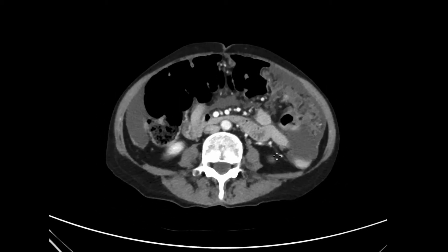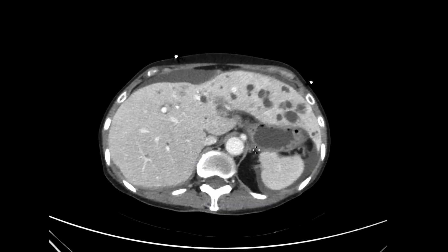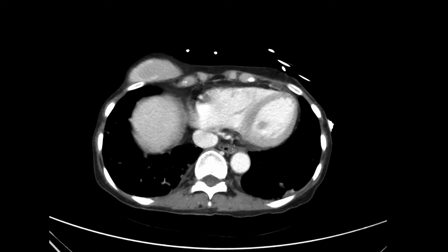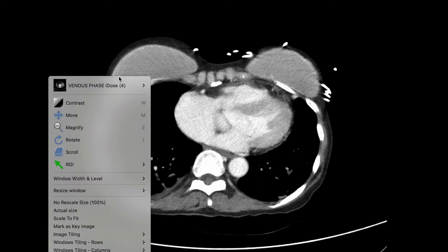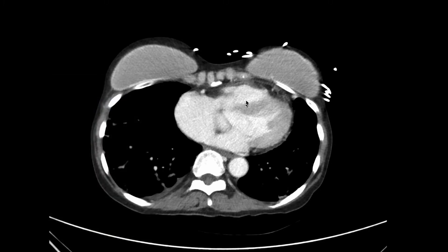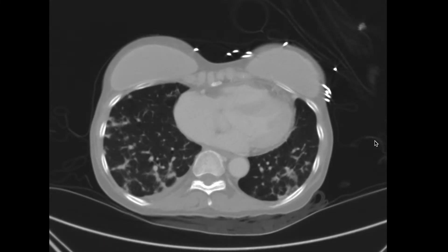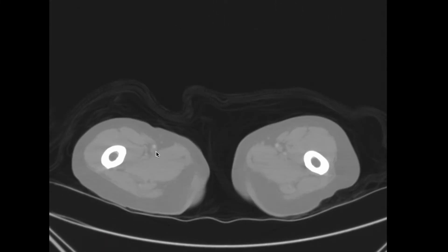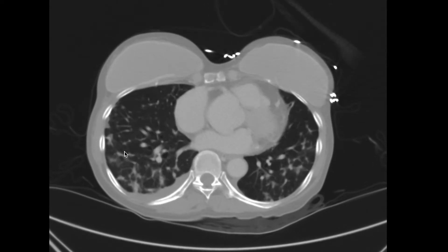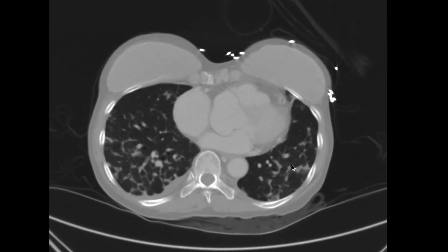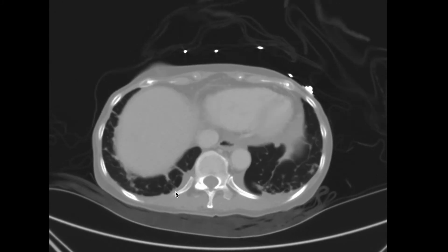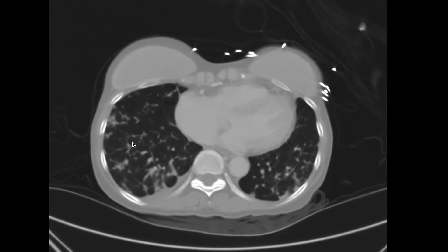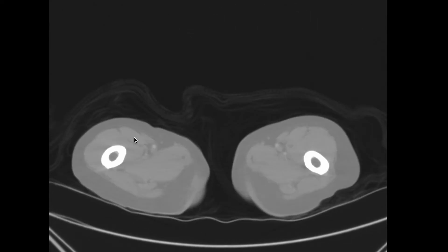In cases of known disseminated metastatic disease, it's important to evaluate the lung basis to look for evidence of pulmonary metastases. We change the windowing to a lung window to further evaluate the lungs. There are multiple small pulmonary nodules within both lungs associated with a small pleural effusion, representing pulmonary metastatic disease.